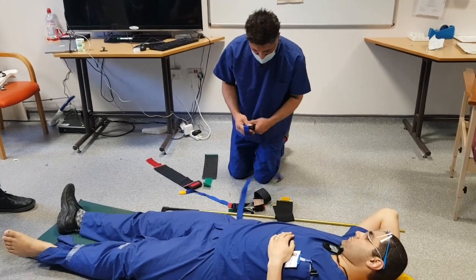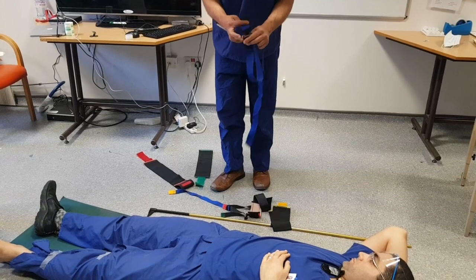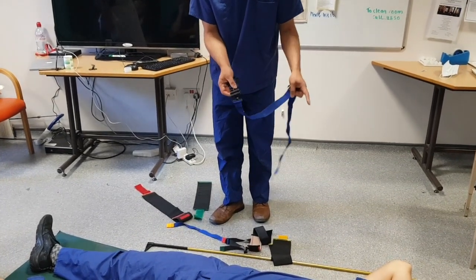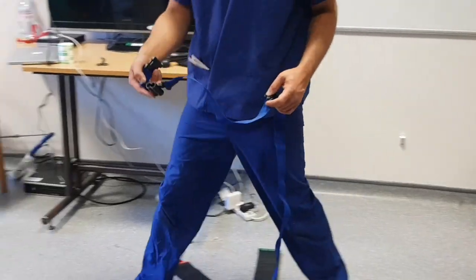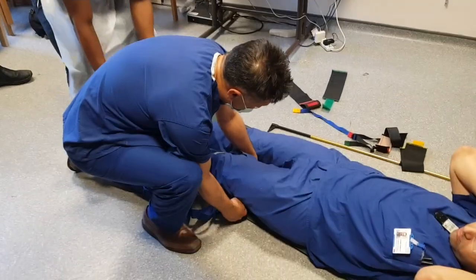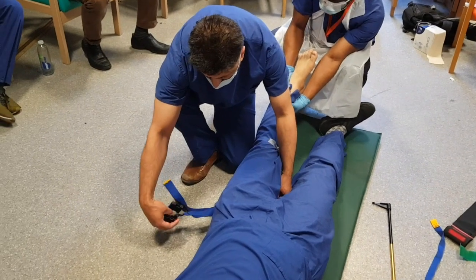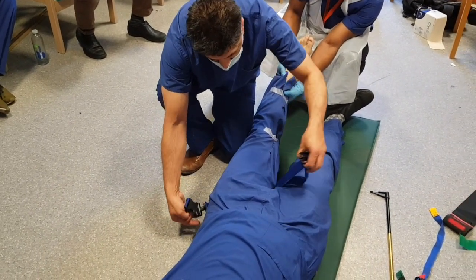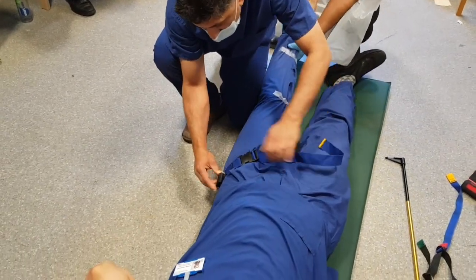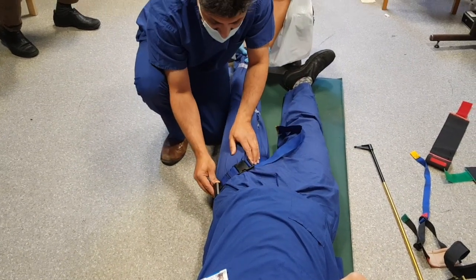The first thing we're going to do is apply this to the thigh. This piece of plastic has got two holes in it which is going to connect with the tent poles, so that has to be on the outside. We're going to pass this underneath the crease of the thigh, which is the groin. It's just clipped together, and I want the area for the tent poles to be right on the side. It might be worth putting a pad in here just for comfort.